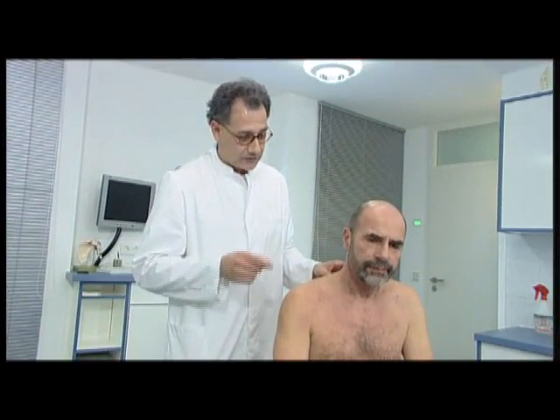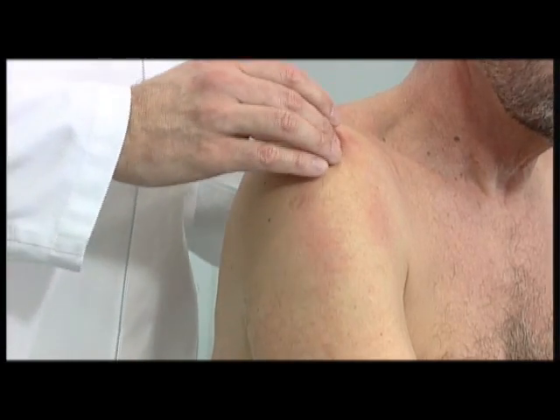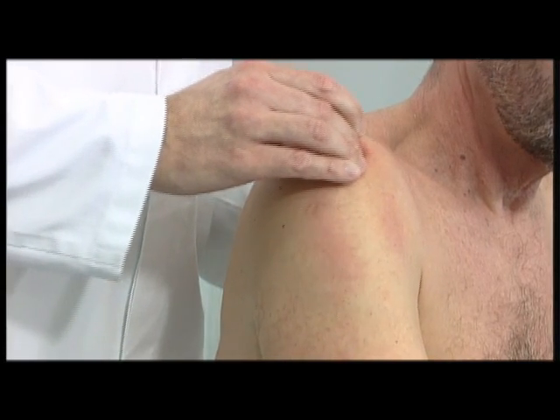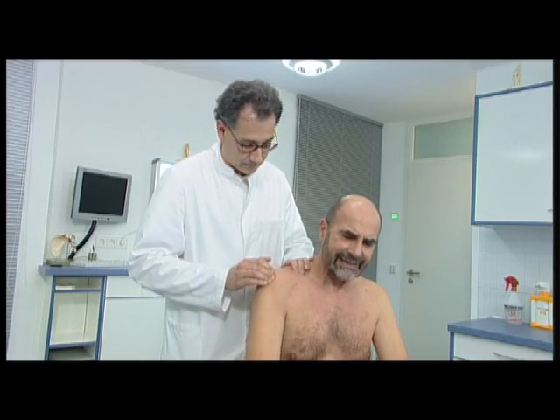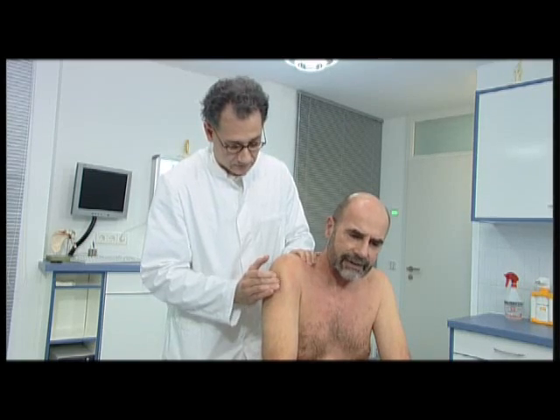Bitte. Flat palpation and movement of the medial deltoid muscle ensures precise localization of the painful spot. Wie ist das? Ja, das. In our case, the point of maximum pain is located at the tendon insertion below the bursa. Genau.